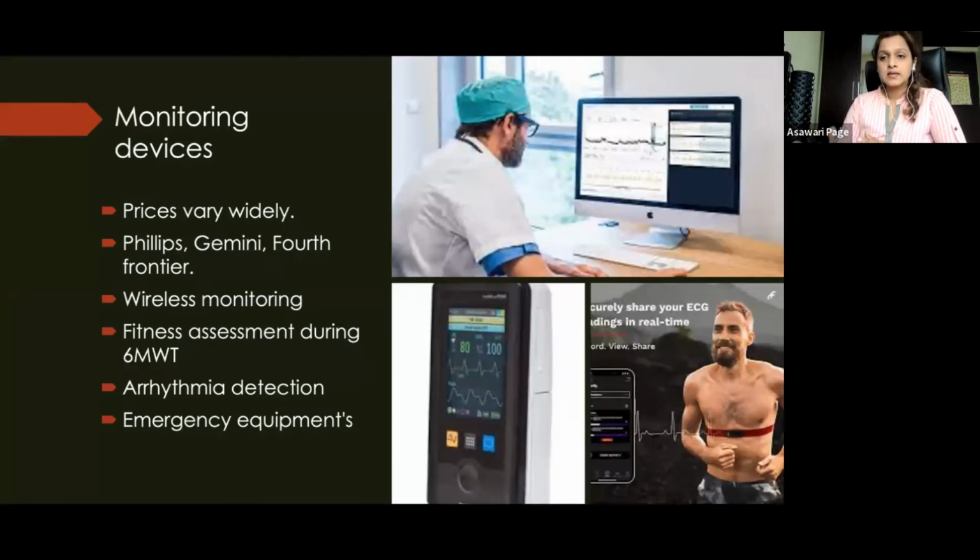So what are the other monitoring devices which are normally used and are cheaper and more accessible? As I'm sure all of you know, the prices vary widely. I have worked more in Mumbai and Pune setups, and in the United States there is a different set of companies which does not exist here. But in Pune and Mumbai, these are the monitoring devices which are usually used and which are equally competent and user friendly.